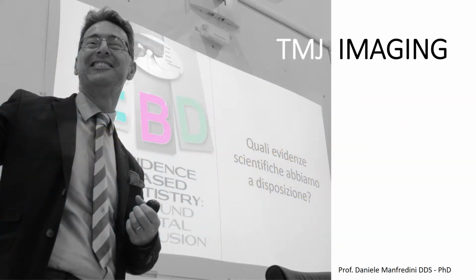Today we are going to talk about TMJ imaging and the disc-condyle relationship.